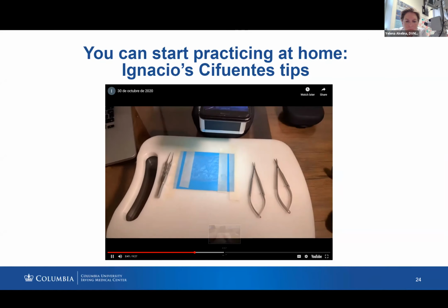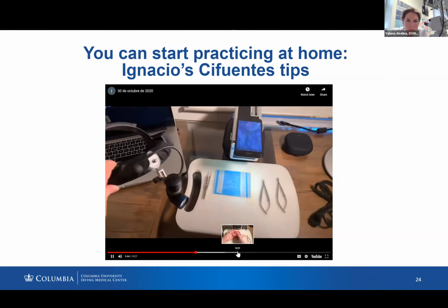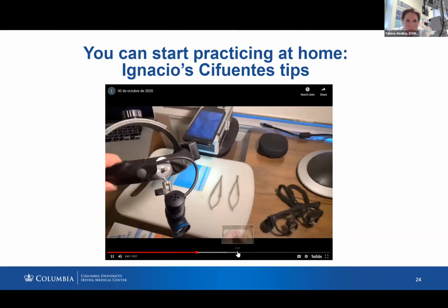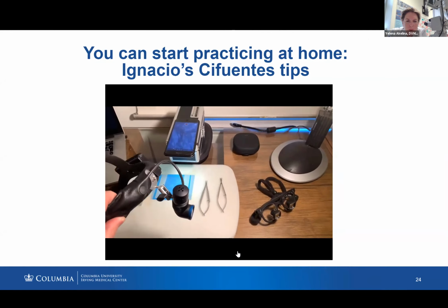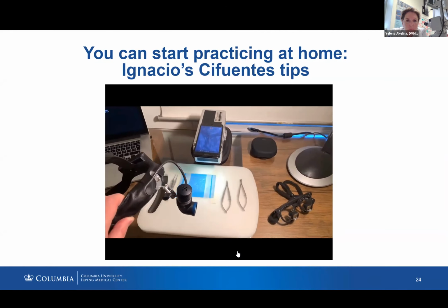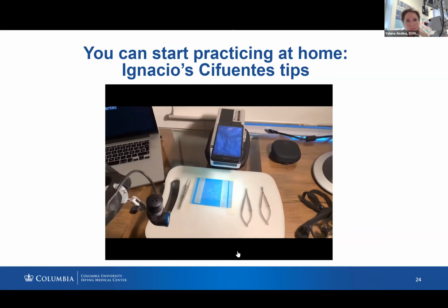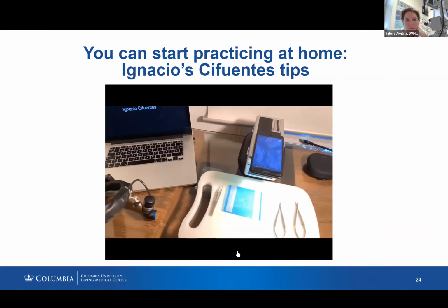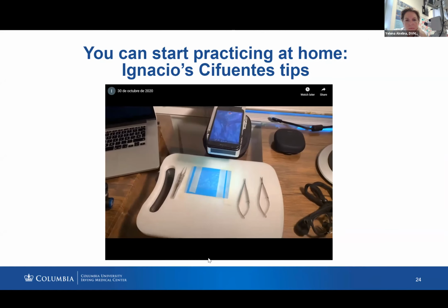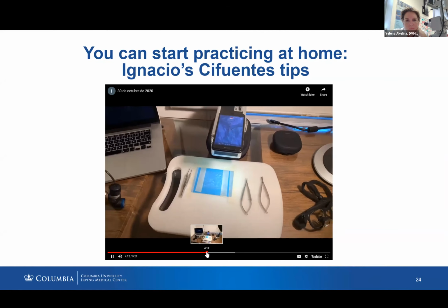But if it's not enough, I also use a headlight loop. I think most of these tools are the basic equipment of many plastic surgeons. So this is very simple to set up. Now I'm going to tell you what we can do with the latex, the plastic bag model through the recording, through the Zoom. And later on, I will tell you how to do the chicken thigh artery anastomosis.